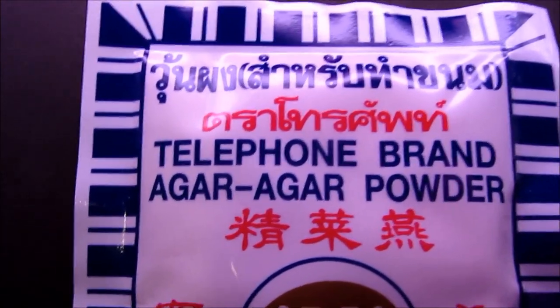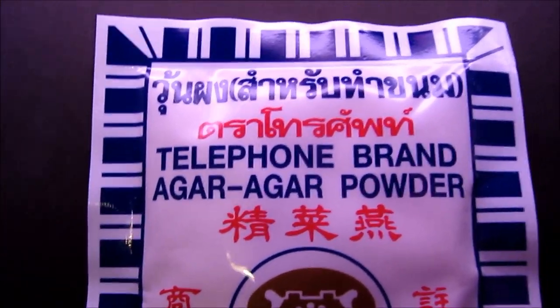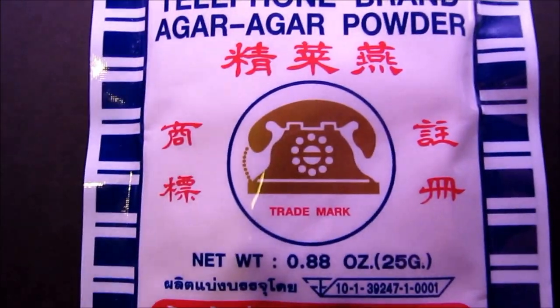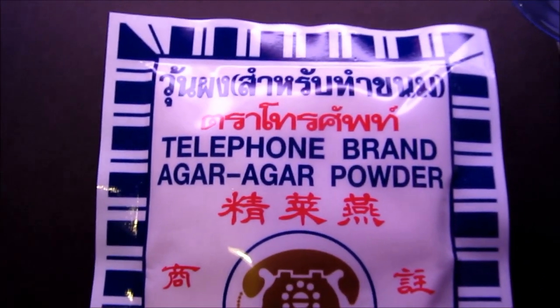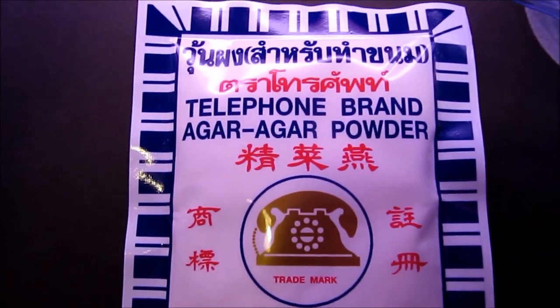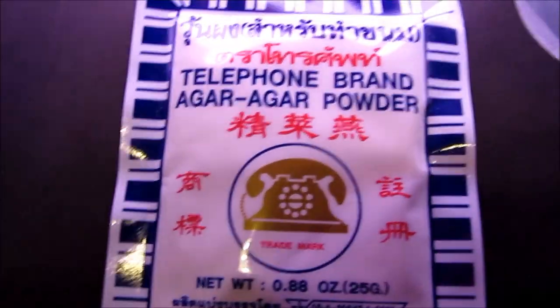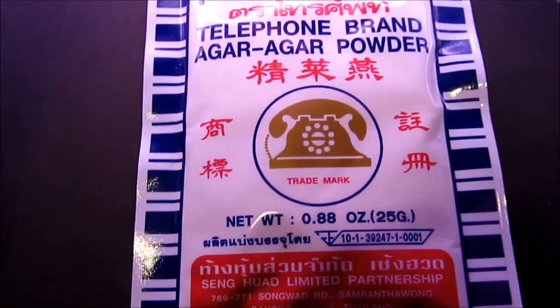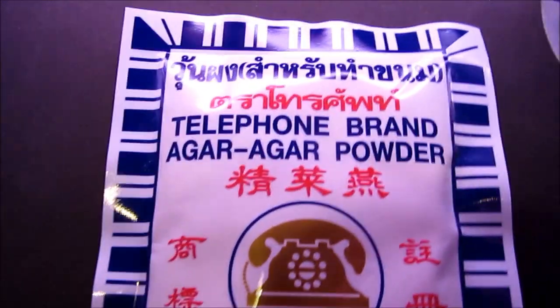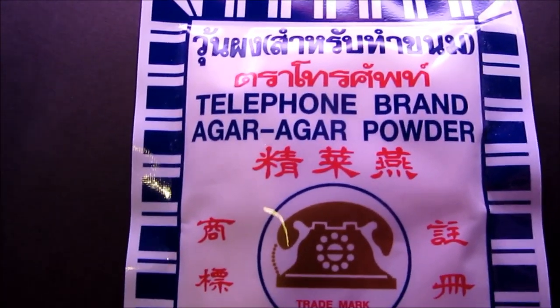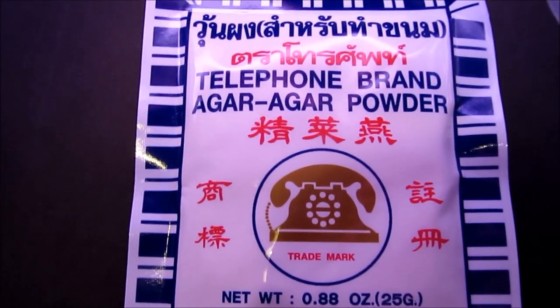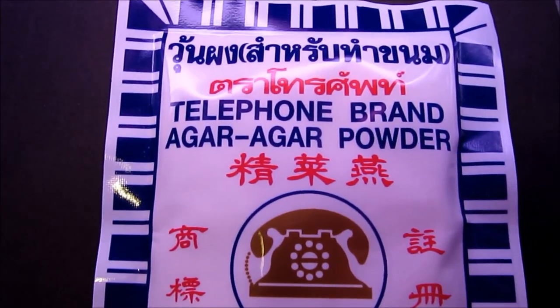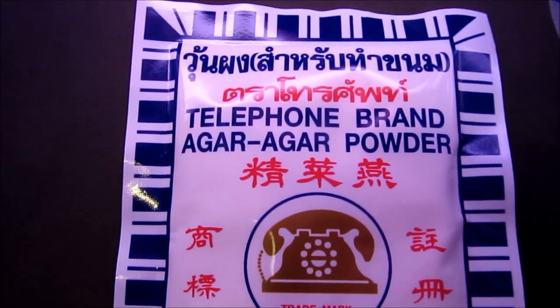Now this is our agar powder here, Telephone brand, as you can see by the picture of the telephone there. Almost any Asian grocery store, some Indian grocery stores will have these. It's sort of like an Asian jello or gelatin that's unflavored. They make a coffee dessert with it, so it's pretty common.